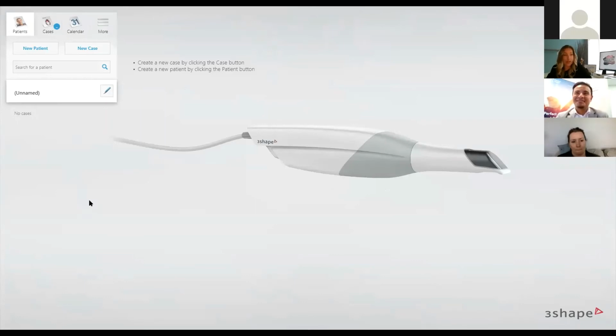I just get so enthusiastic about this. You know, I got into dentistry because my teeth were horrible. And if I had this, I would have had my teeth corrected so much sooner. And so I think that this is just an invaluable tool. And I know I have some colleagues on here listening who are not using it. And it just drives me crazy when we get together and they're just like, oh, no, I can't be bothered. Well, you need to. You have to.